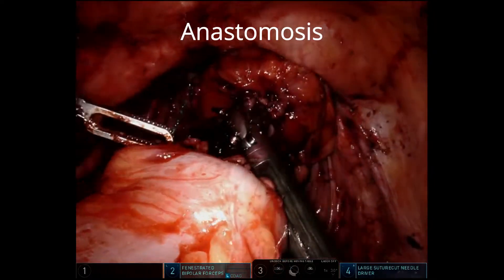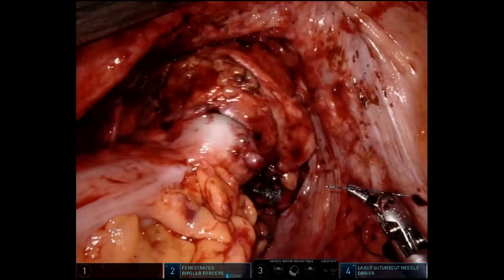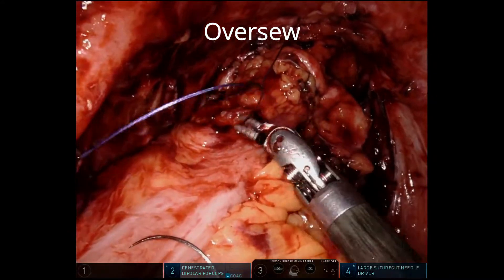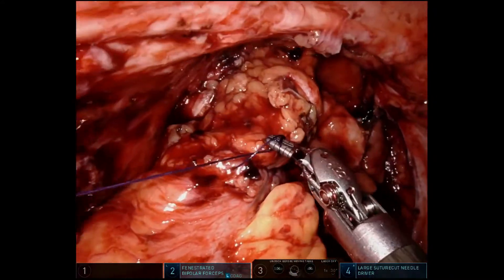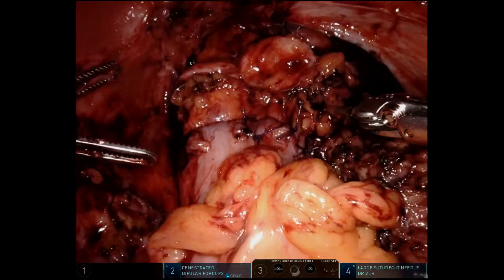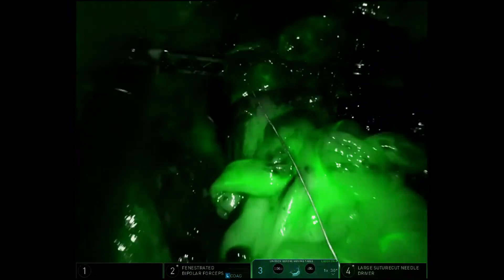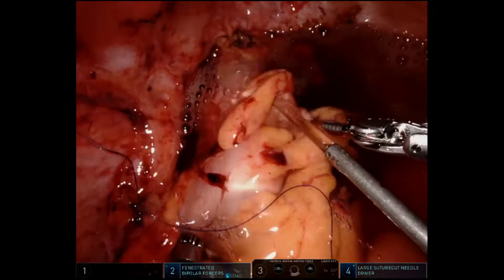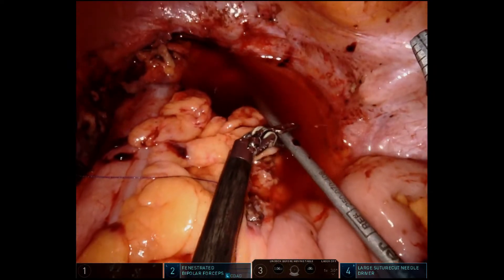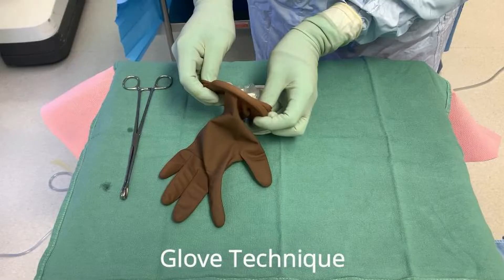We put the anvil and engage it to the spike, then close it down, gently lifting on the sutures to keep everything tight. There is our colorectal anastomosis. We always evaluate the anastomosis very closely and have the opportunity to place interrupted over-sewing sutures if we see any areas of weakness. We then do direct visualization and an ICG fluorescence imaging to make sure everything looks viable. We check the anastomosis with direct visualization — you can see the tip of the proctoscope — and then the air insufflation test. This illustrates some of the mitigating procedures we use when there is suspicion of COVID-19, using the glove technique.